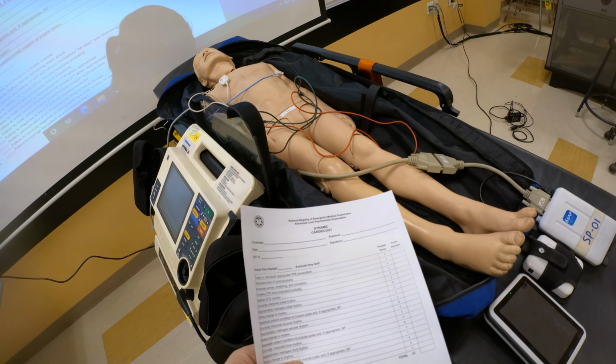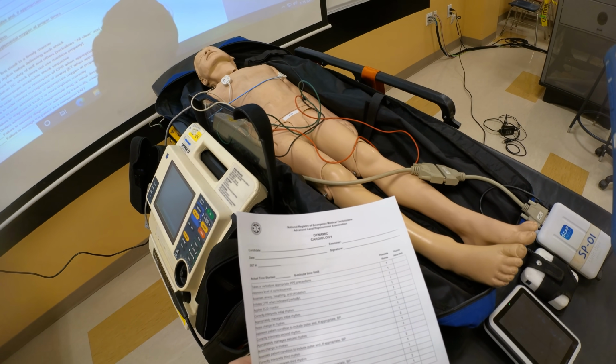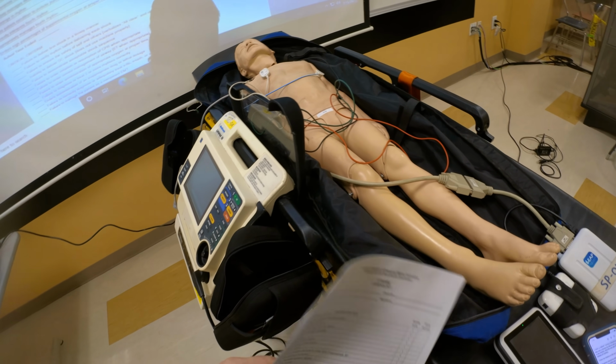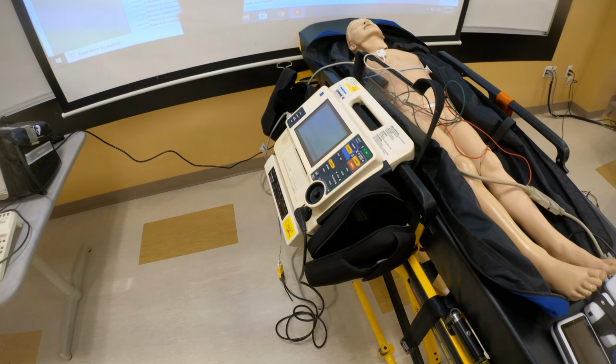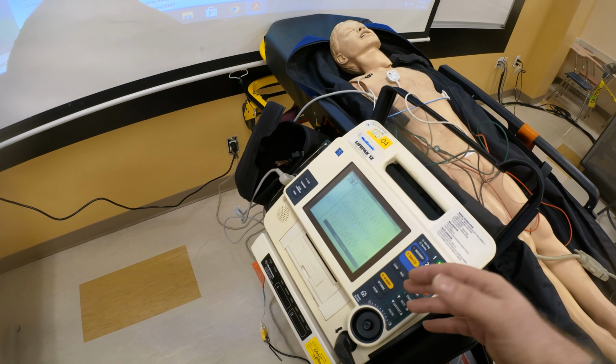The next thing I want to address here is: what is the student actually performing? The student is doing psychomotor skills. They're not here to verbalize anything. So I actually want to see them charge, shock, and do all of this.